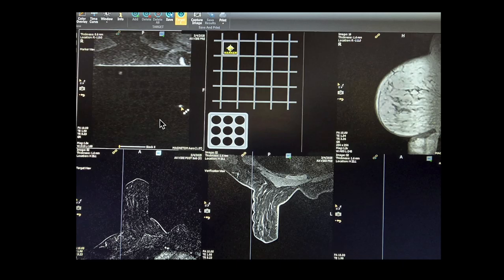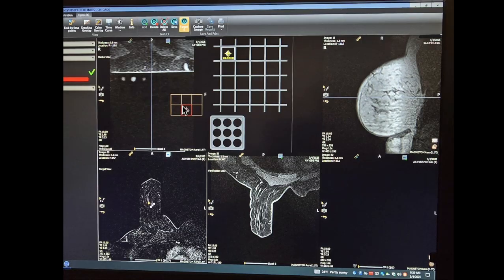So on this image, it is a sagittal image, and basically you scroll all the way until you see the fiducial, which will be outside the breast. So this is where the breast would be, but you don't see it on this image because you have scrolled to where the fiducial is. And when you see the fiducial here, you put the mouse on top of the fiducial and left click so you can tell the Dynacad program where your fiducial is.